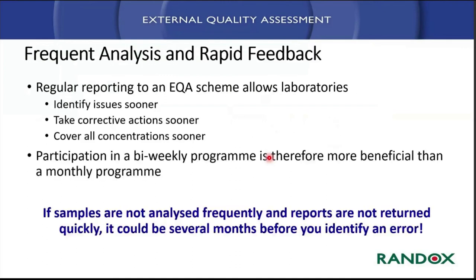Frequent analysis. If the samples aren't being analyzed frequently and reports aren't being returned quickly, as I mentioned earlier, it could be several months before you identify any errors. So how do you ensure, if you have corrected an issue, that it's been effective? It's very difficult if the analysis isn't frequent.